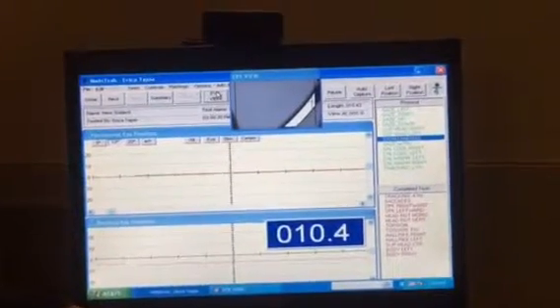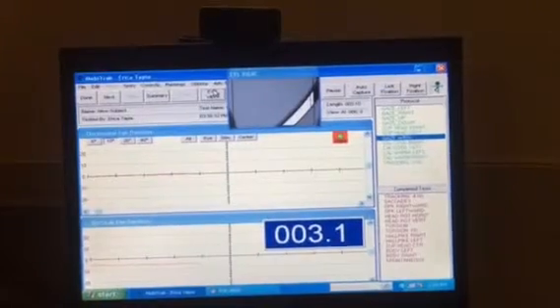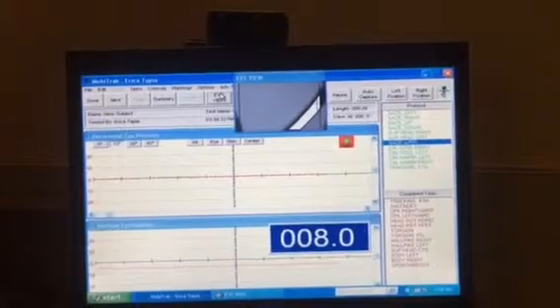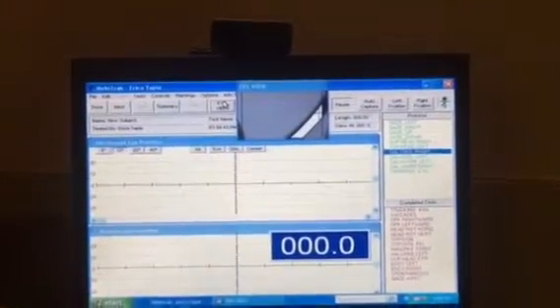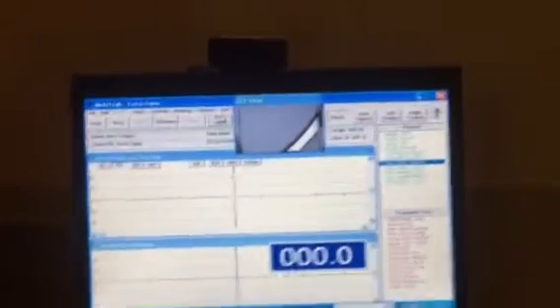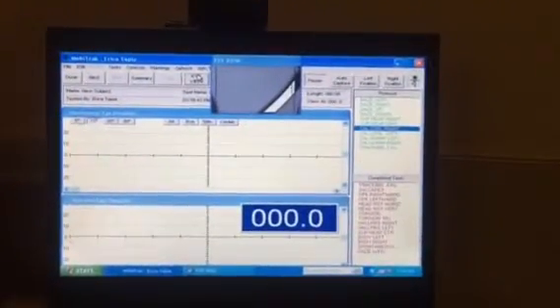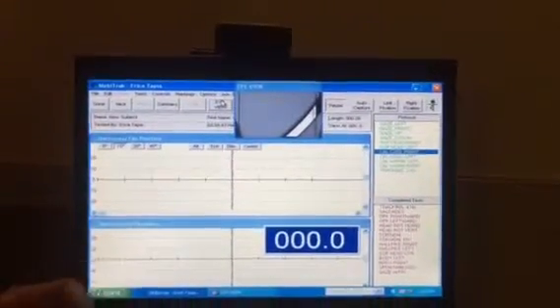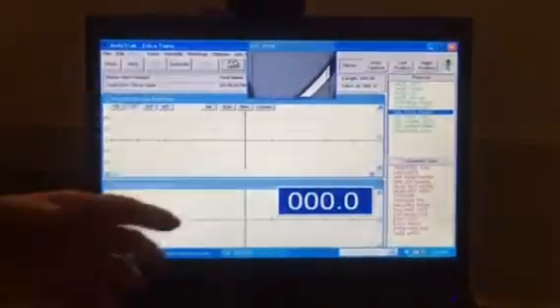And then the next test, same thing. The lights go on. Your patient is in the final position. Now the software will calculate, it will subtract what happened before, because she's in this position looking forward. If she has 5 beats, then that was already there to begin with. So your calorics, instead of 20, will report 15 because 5 was already there to begin with. That's why you stay in the same position.